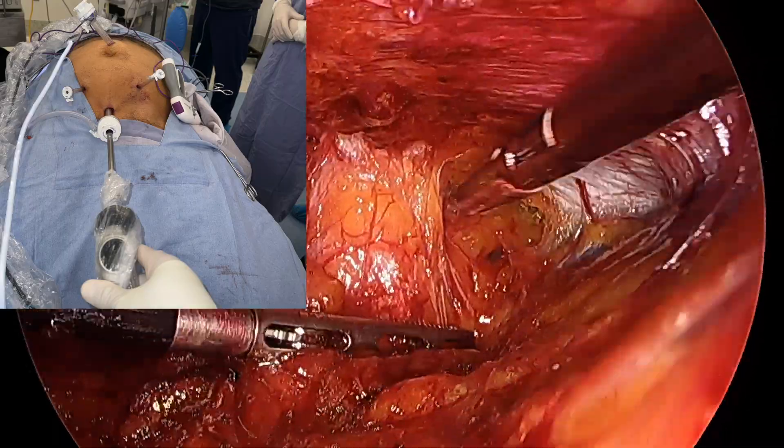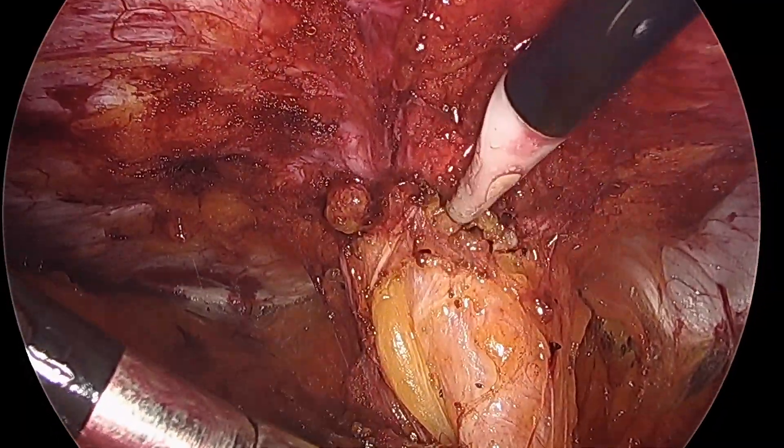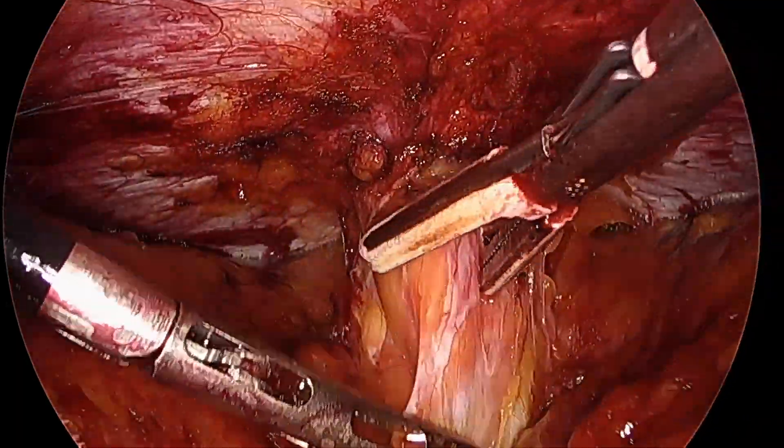On the left, you can see the way the ports are placed and how we're working. The ports on the working arms are a little higher so you don't collide so much with the legs.